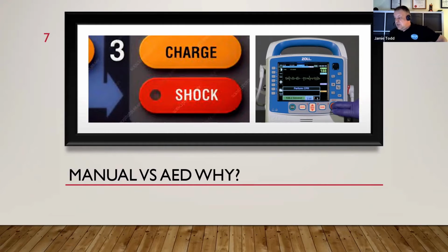So that seemed acceptable. But for our purposes, arriving on scene as a healthcare deliverer, that seemed incredibly slow, while you just sat and watched. Of course, with an AED, for most of them, you couldn't do CPR while it was thinking, because it counts that as movement artifact and dumps. So you couldn't touch the patient for a considerable length of time. So it led to very long delays in CPR.